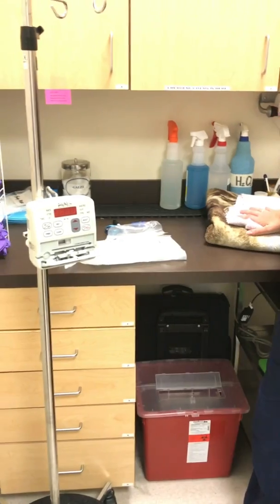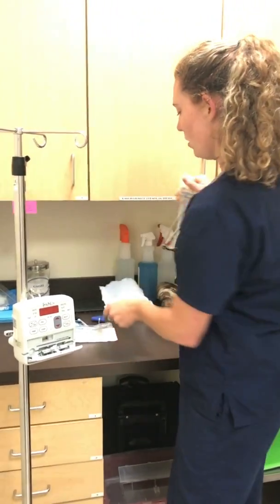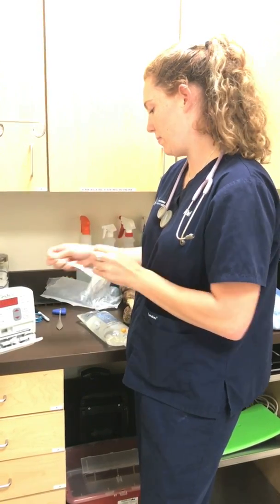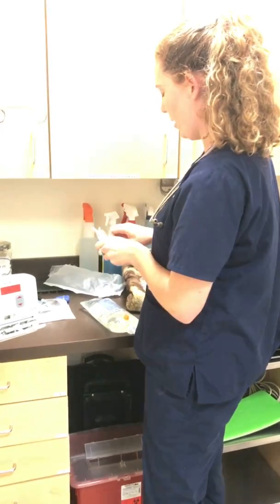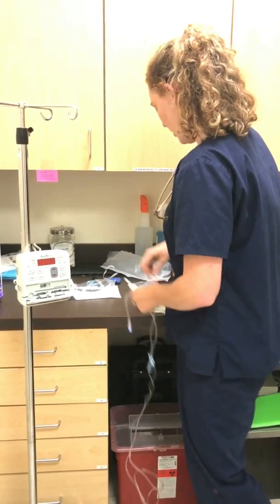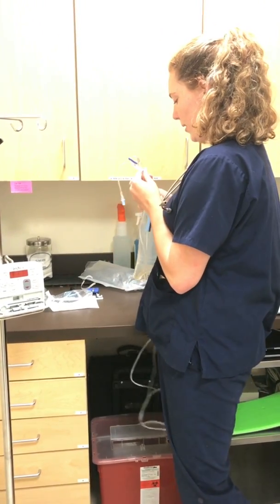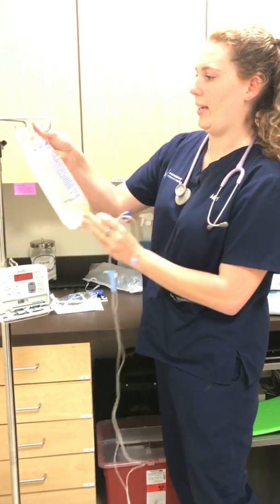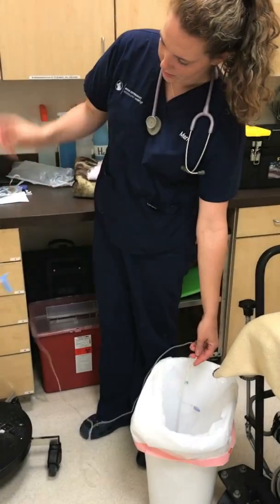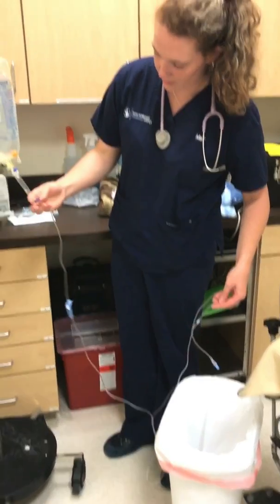And then lastly, we've got our fluids. So I've got a liter of lactated Ringer's here. I'm going to use a macro drip infusion set. We'll go ahead and spike our bag and prepare that. Okay, so I'm going to take the cap off of our infusion set, remove the plug, cap that, and spike our bag. Go ahead and hang that up and flush our line just to make sure that there's no air bubbles in there. And as you can see, it's dripping through the other end with no air bubbles within the line.